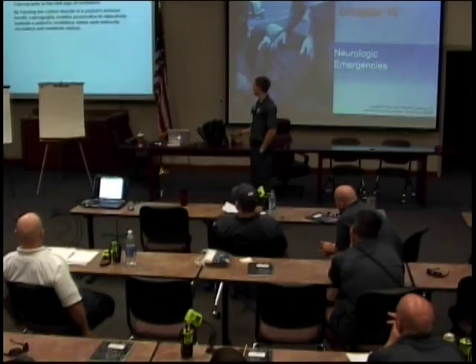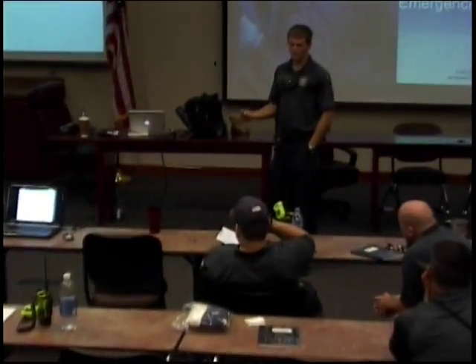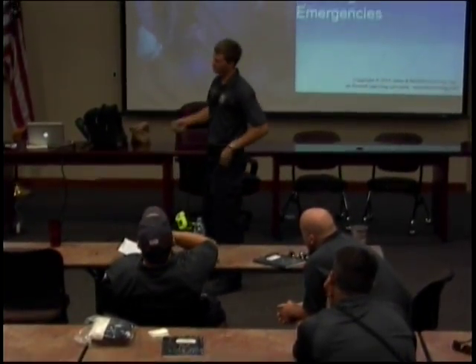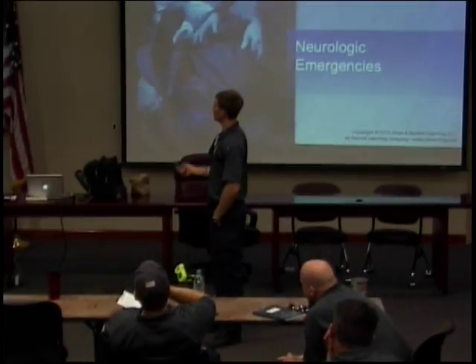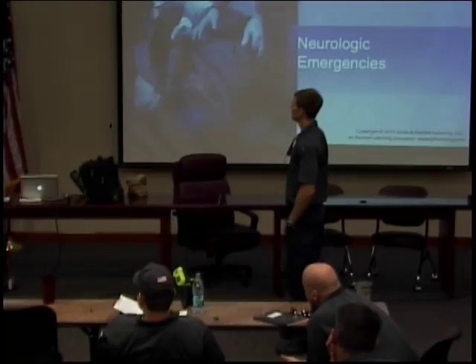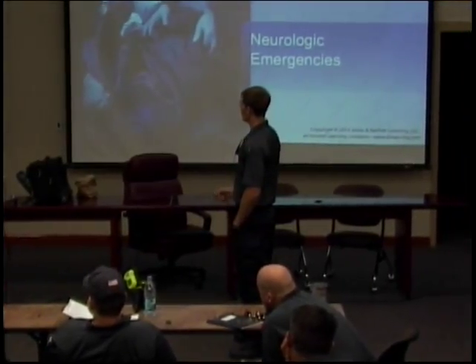Ventilatory status, and indirectly circulatory and metabolic status. So by using this one thing, you get access to a lot of information that you can use to help dictate where you want to go with your patient. A couple definitions. Capnography is the measurement of carbon dioxide in the exhaled breath. Capnometer is the numeric measurement of CO2, and capnogram is the waveform. End-tidal CO2, EtCO2 or PEtCO2, is the level of, or partial pressure of, carbon dioxide released at end of expiration.